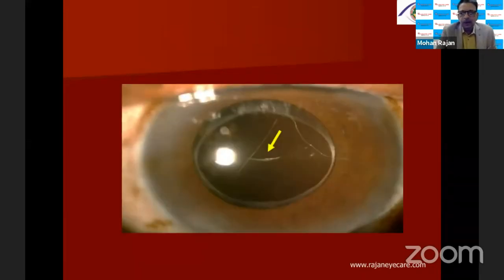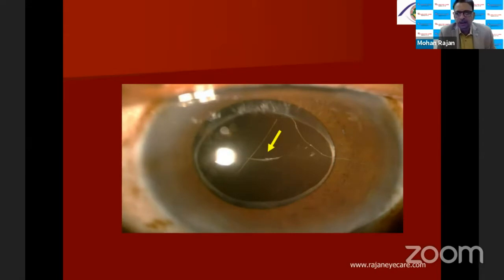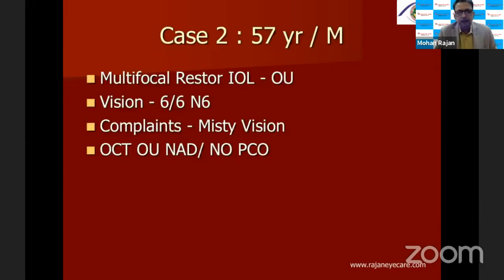Another patient can be unhappy. This is a patient who had a crack on the lens. I thought it would go away, but the crack persisted. The patient had polyopia and starbursts, because it is there in the visual axis. This patient was also very, very unhappy, and I had to explant the lens and put another lens as well.